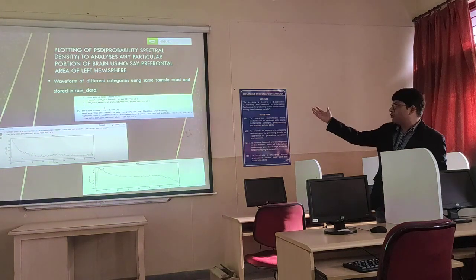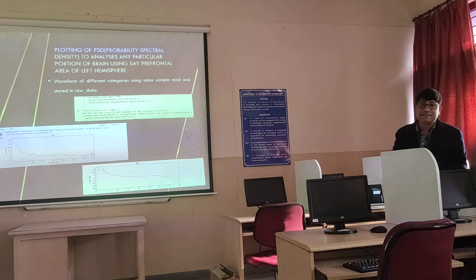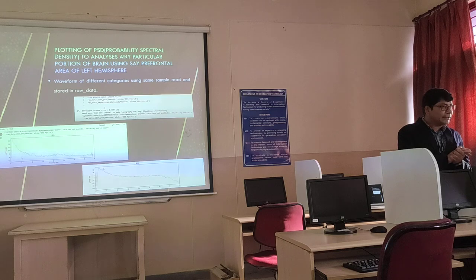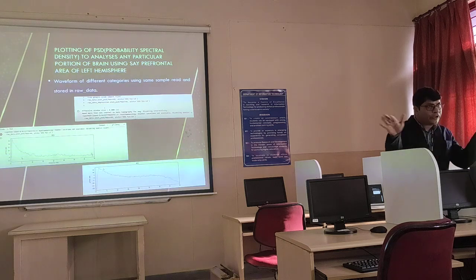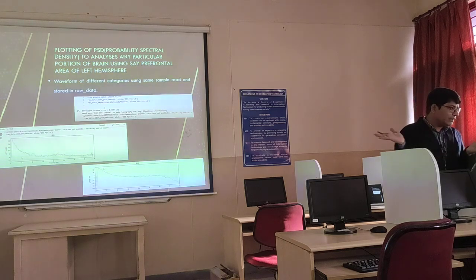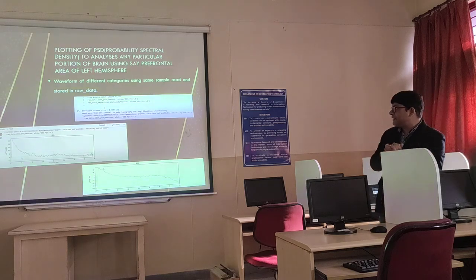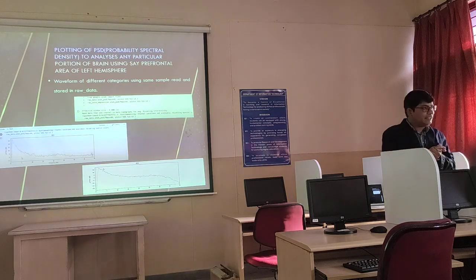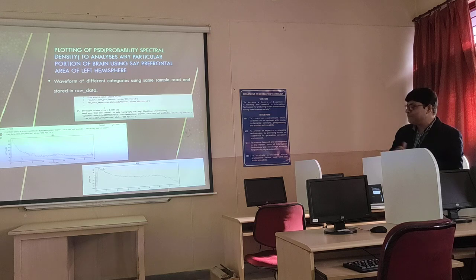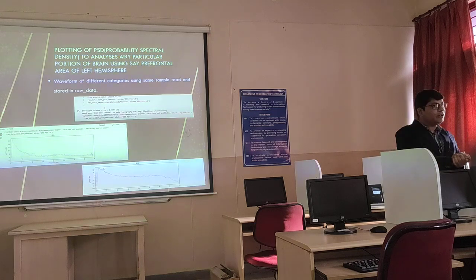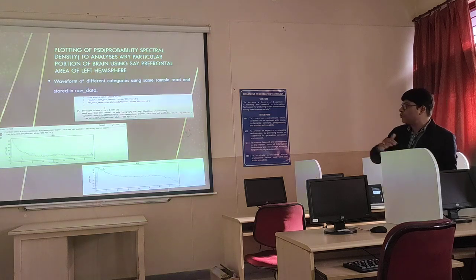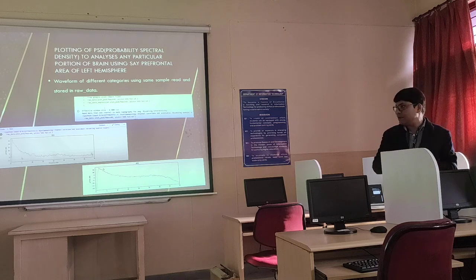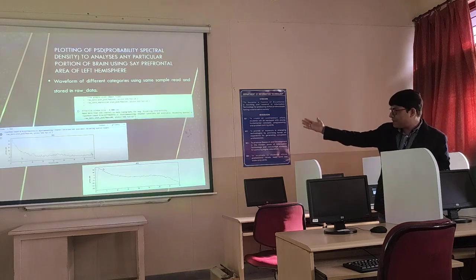After reading the data, you can simply plot it. Using the plot_psd function — which gives you the Power Spectral Density — you can pass the maximum frequency you want to see. For example, from 0 to 40 Hz. You can also specify which channel or portion of the skull you want to pick — for example, prefrontal left. These two graphs are collected from two different datasets: one from a person with a sensitivity disorder and one from a normal person.